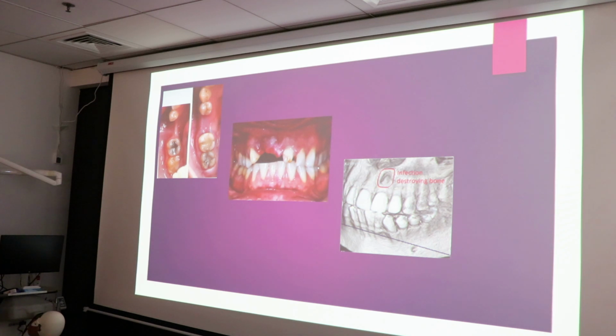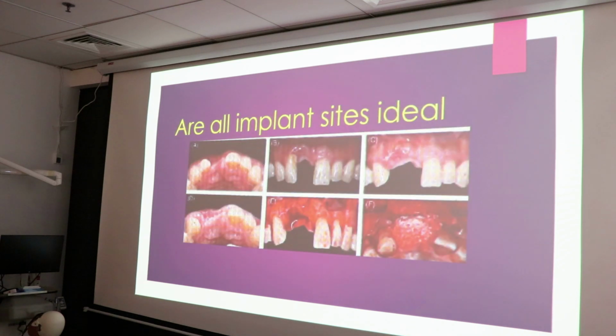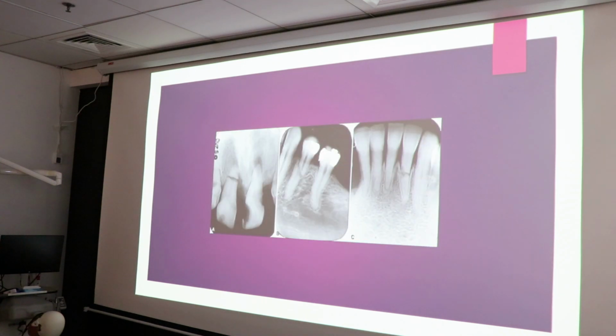And the procedures which you have been thinking of are basically invasive, and that was the presentation that was made by Dr. Suhail, to think in terms of an alternative treatment, which is the non-invasive one, which is your orthodontic extrusion. So think along those lines. Not necessarily should it always be in terms of graft, or an invasive procedure, putting the patient through all that. Of course, time is a concern, but this is a non-invasive procedure and it is definitely going to be easy for the patient. You get to think in terms of doing the bone graft there, and this is an invasive procedure, but think in terms of these kinds of situations.